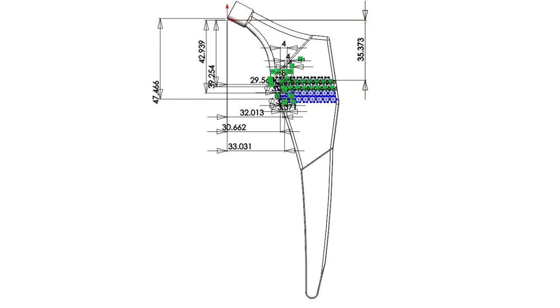From other people that have created this, we notice that they have a coated layer on top of the stem. However, what I'm doing is creating the porous structure directly on the stem itself. So it's two different parts which I should be analyzing. And yeah, this is my final porous structure design, yet to be finished and analyzed.